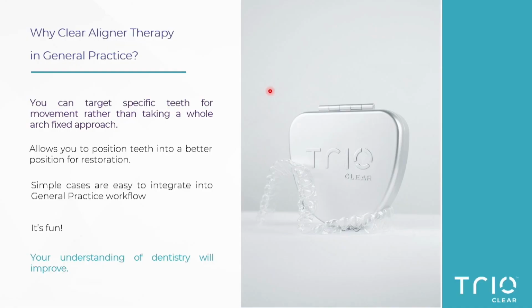We're able to target those moves onto certain teeth and put them into a better position, either for aesthetics or to restore them. Simple cases are really easy to integrate into general practice workflow. I find it fun, and I think it's actually made me a better dentist because I've got a slightly better understanding of how the teeth move inside the arch.